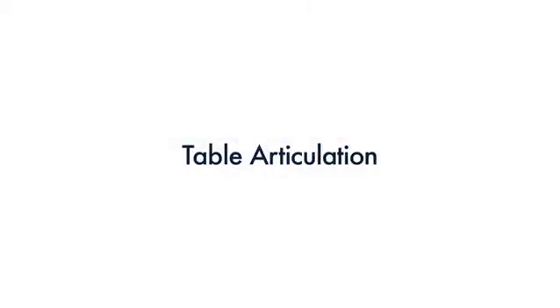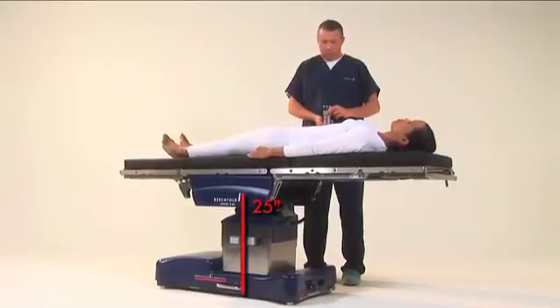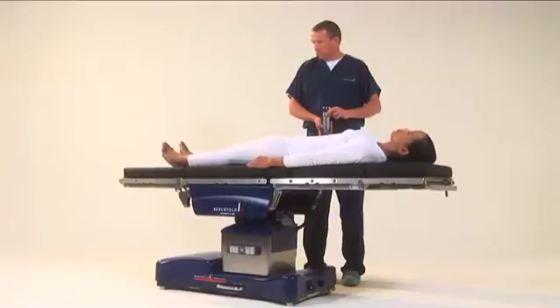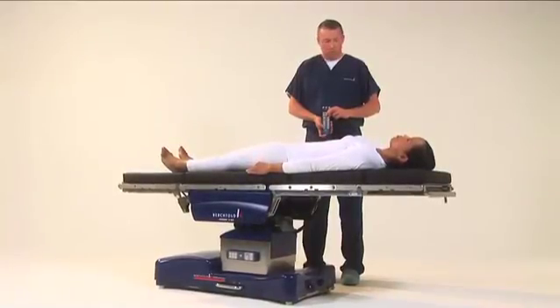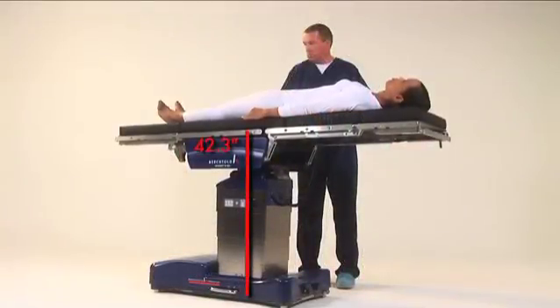The D820 can be lowered to 25 inches, measured from the floor. To lower the table, press and hold the table down button until the desired height has been achieved. The table can also be raised to 42.3 inches.